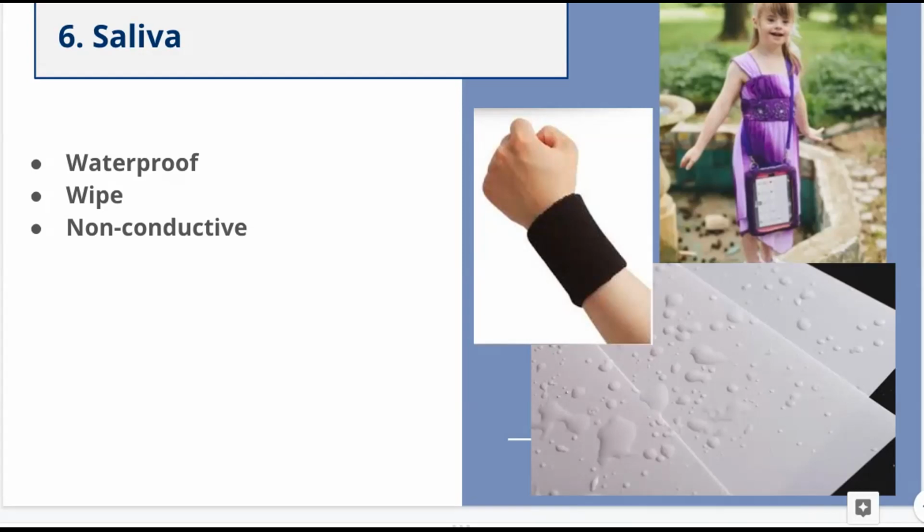And then I always like to empower people, if possible, to be independent. So I'm showing this lovely tennis accessory, which you can utilize to clear the screen for accessing again, to help manage that wetness.